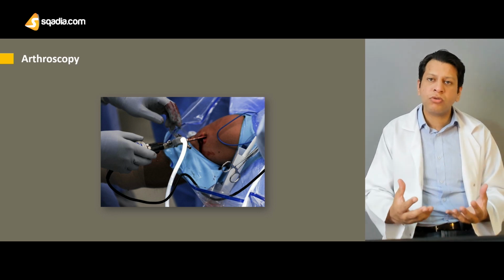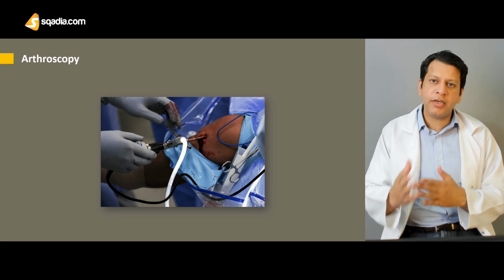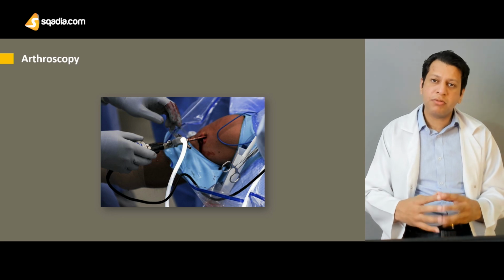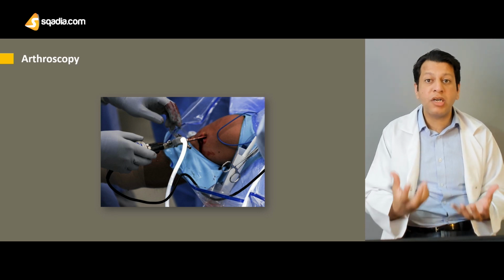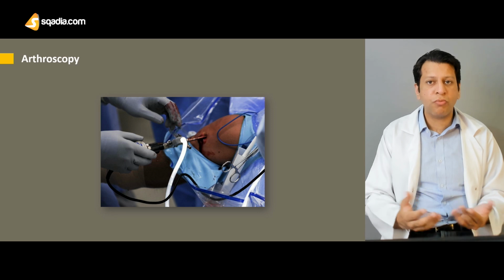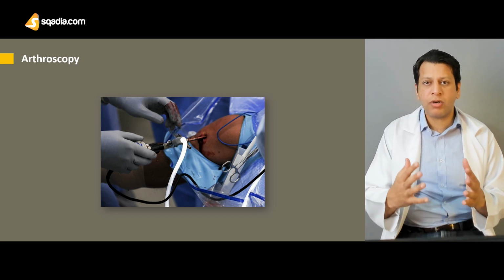When they did the knee arthroscopy, they used to view it. If something was wrong, they used to come out and do an open surgery to correct it. So this was what was happening before 1980. In the 1980s, there was another Japanese scientist, Dr. Masaki Watanabe, who developed interventional arthroscopy, and he can be credited as a pioneer of modern day arthroscopy. That is, you go in, you see the pathology, you correct the pathology with the use of an arthroscope, and come out without really opening up and giving a large incision. So that is how it has evolved over a period of over 100 years.